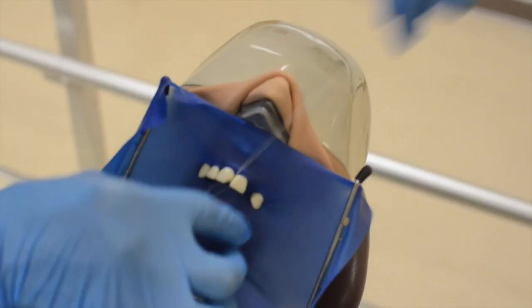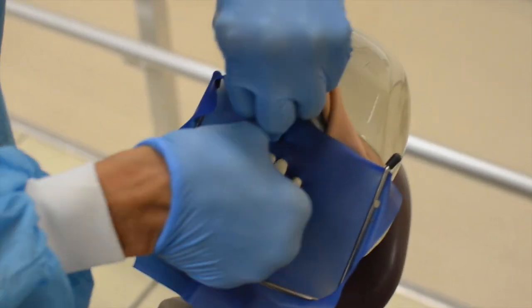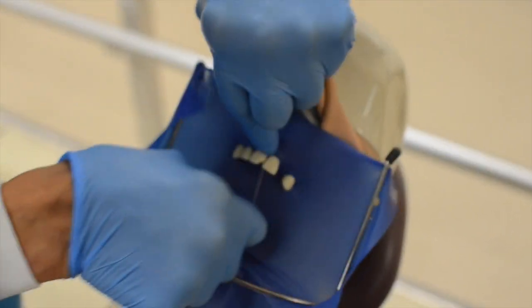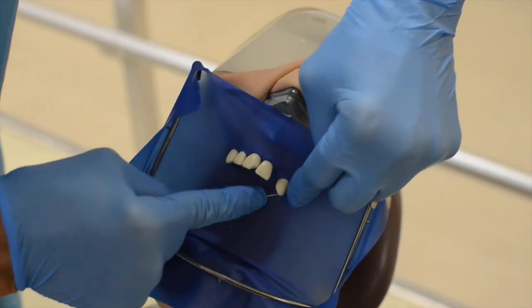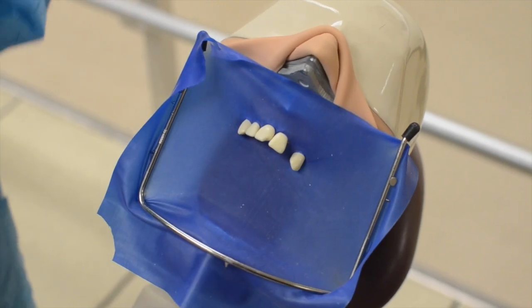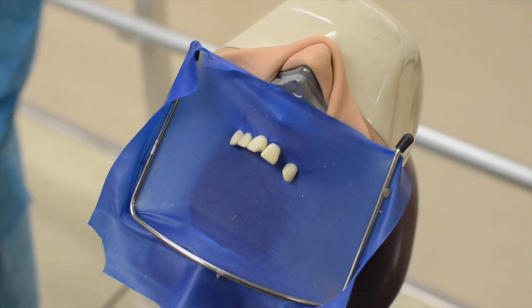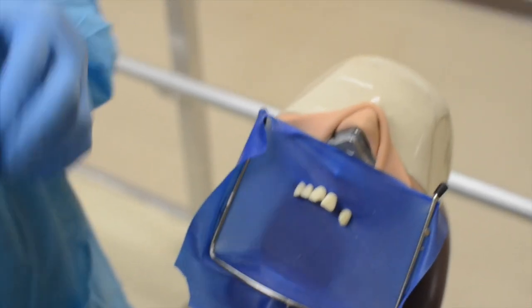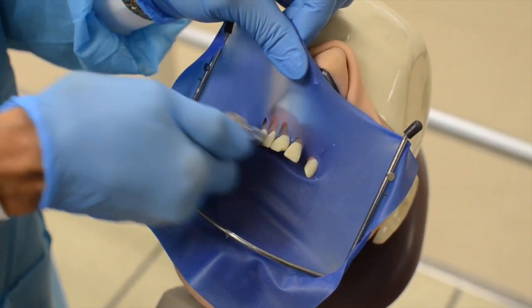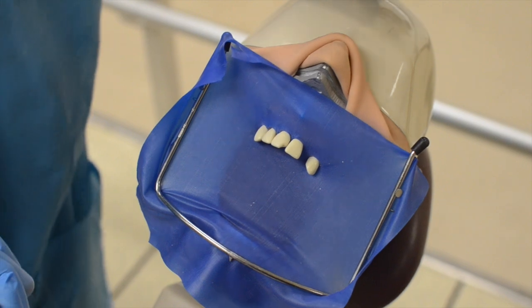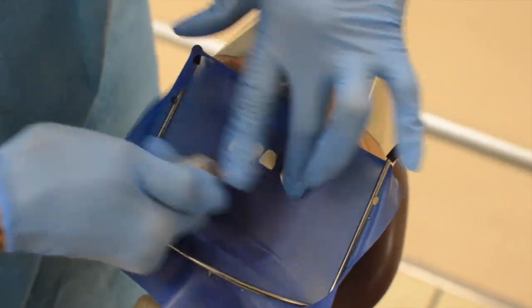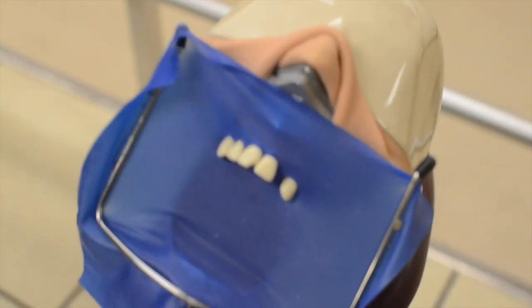I just realized something else I didn't tell you guys. When you're working in a patient, everything's wet. You want your rubber dam to actually evert around the neck of the tooth. How do we do that? If you stretch the rubber dam, like so, and dry it off the teeth simultaneously with an air tip, and then let go, this rubber dam will actually curl around the necks of the teeth. On our typodon it's easy to do this.